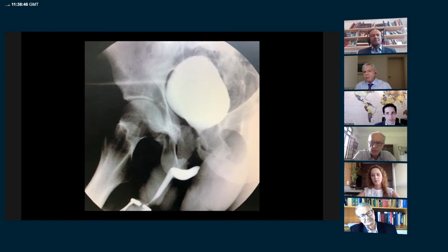Okay, so we start with a flexible antegrade cystoscopy to decide the approach, if abdominal or perineal. I always perform perineal. Many years ago, I performed abdominal, like Turner Warwick, and other professors made abdominal and also took out the pubis to assess anteriorly. But nowadays, we can do it from below. If necessary, you can also take some part of the pubis from below. And in most cases, we can assess the apex of the prostate or prostatic urethra. Okay, so perineal approach based on this evaluation.